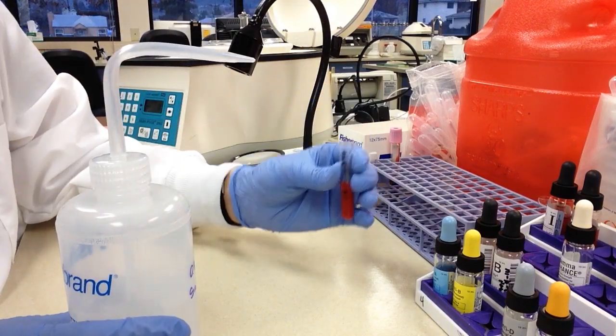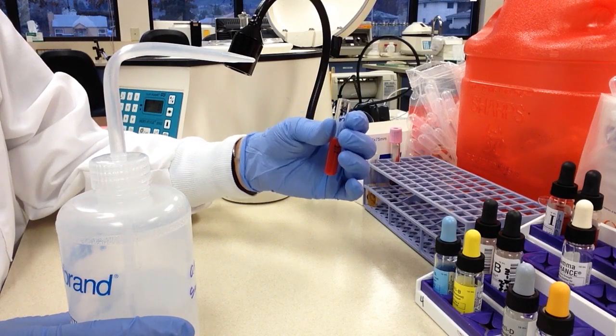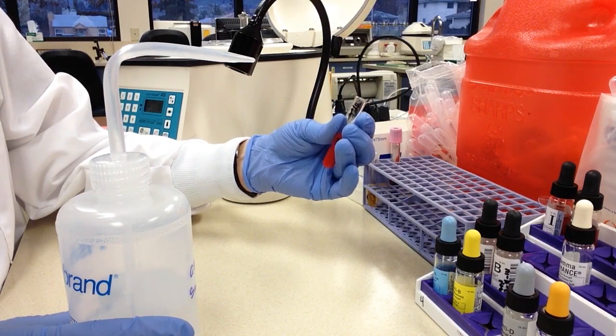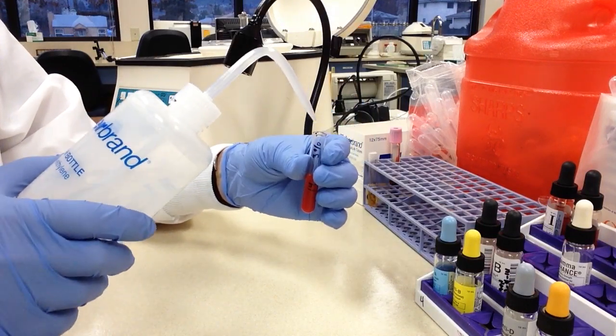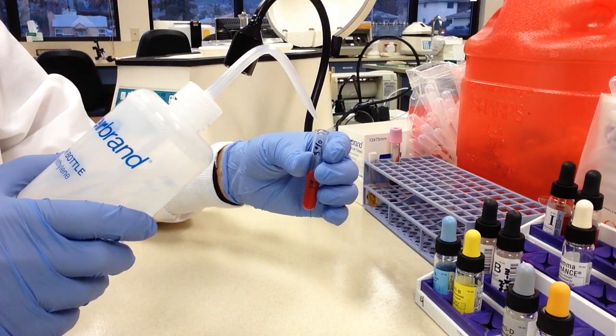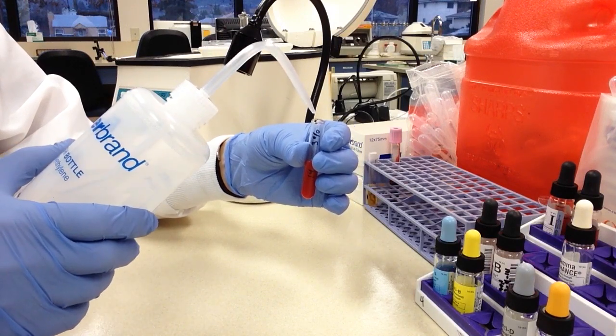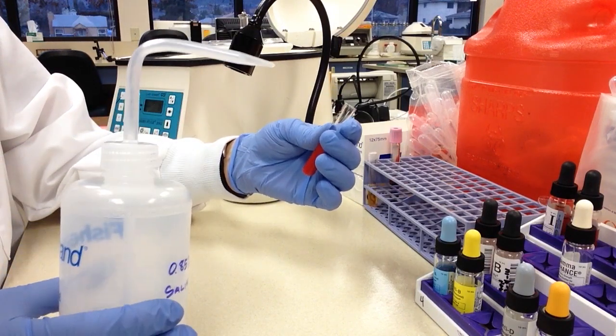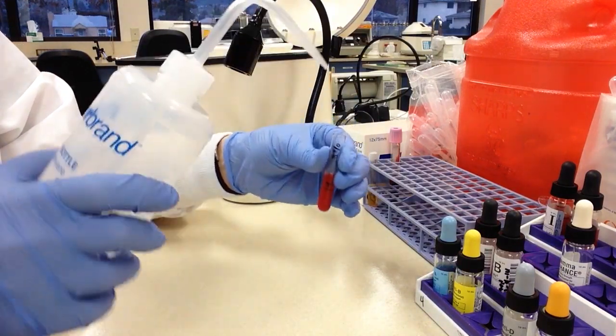Now, one thing you have to be careful about when you're pipetting or you're putting things in these tubes is, especially if they have something else in it, you don't want to contaminate. So you can see that I'm being very careful about not putting the tip or touching the tip of this saline bottle to this tube because there's blood in there and I don't want to contaminate the saline tube.